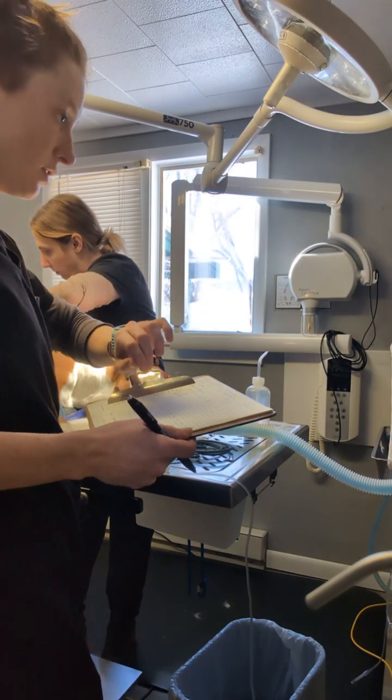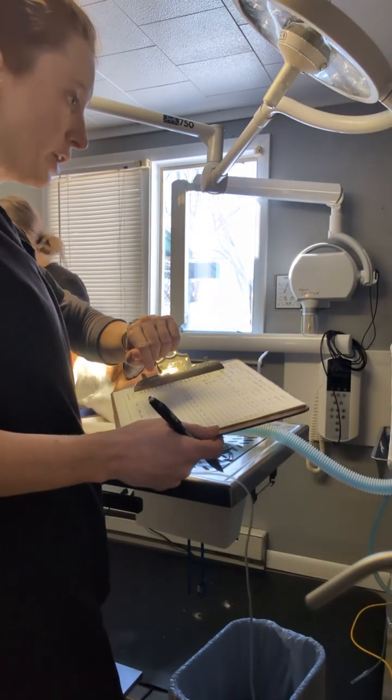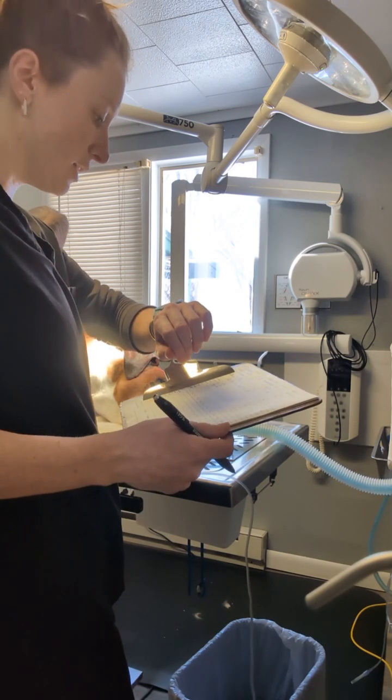I tend to use the reservoir bag on the anesthesia machine to count the respiration rates. It does say it on the pulse oximeter machine, but I like to just confirm that what I'm seeing is the same.